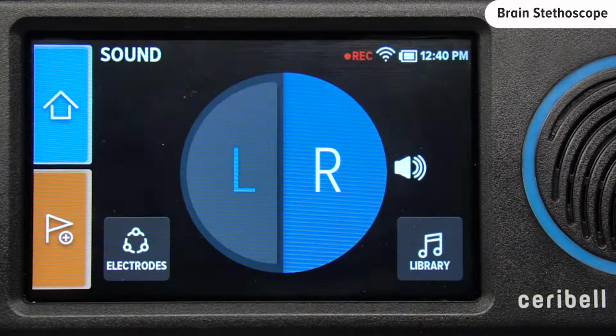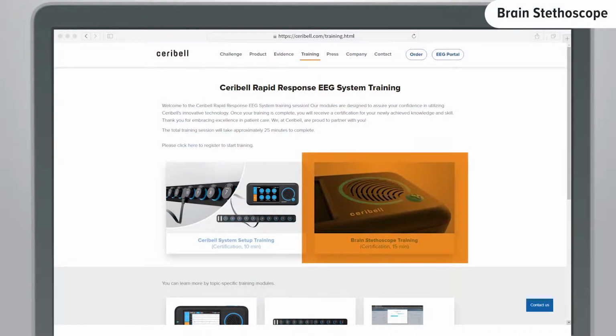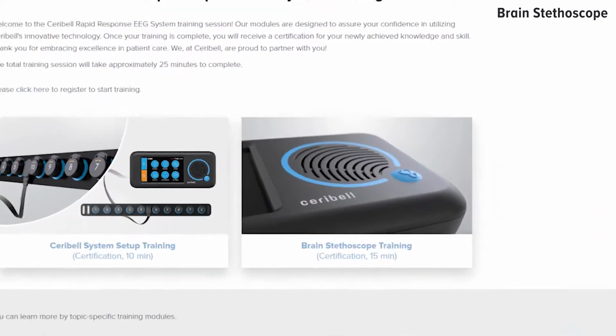With the brain stethoscope function, a normal brain sounds like white noise. A seizing brain has a distinctive, rhythmic, and repetitive sound. To use the brain stethoscope appropriately, you need to complete a different module on the Ceribell training website.